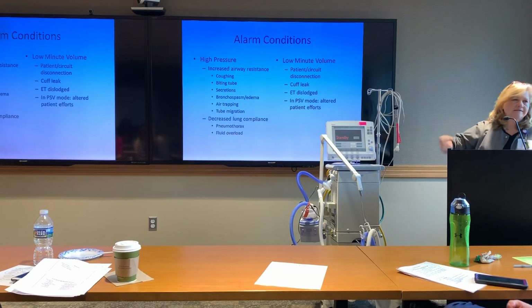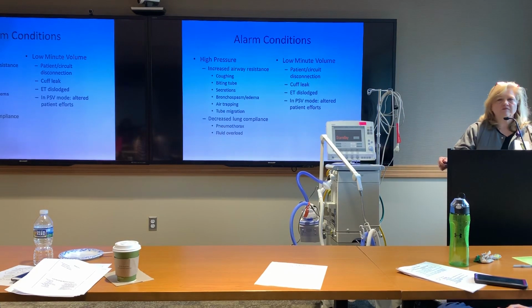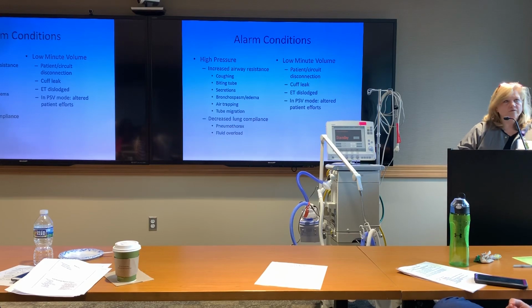The other alarm that this has is a high minute ventilation alarm, which is the one that goes off when we're annoying the patients and turning them on their sides. That's usually just an annoyance thing, because people don't like to breathe more than they're supposed to. If our CO2 gets too low from breathing too high, we stop doing that. Not all your patients probably behave that way, but in general, they're not going to keep breathing that fast. So I don't really worry about that high minute ventilation alarm too much.